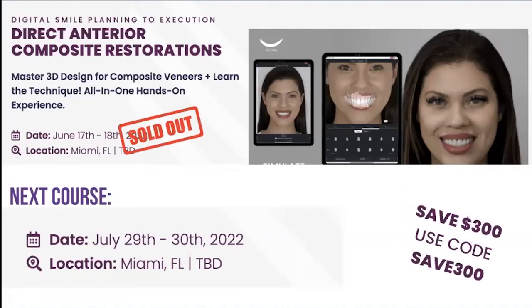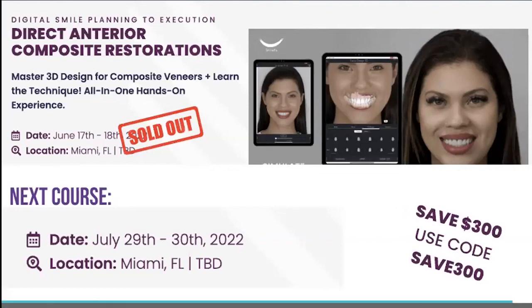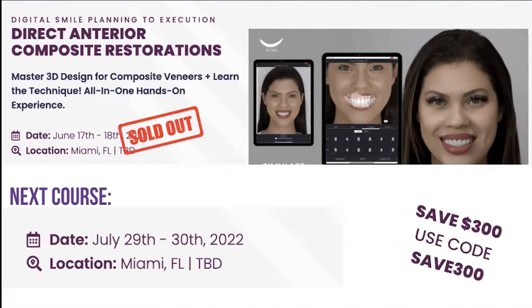Now, my very last question is, do you find SmileFy 3D wax-ups useful for your practice? So I have a poll here, and I would like to know from you guys now that you have already seen the entire workflow.